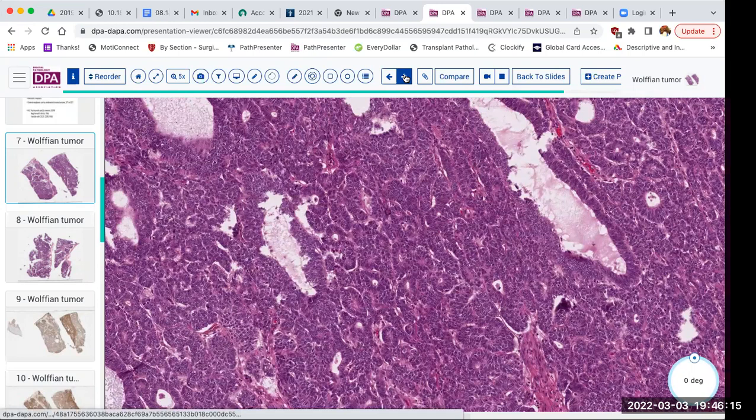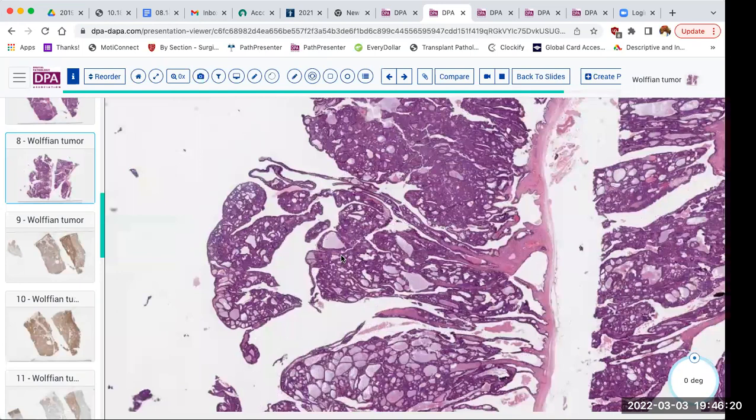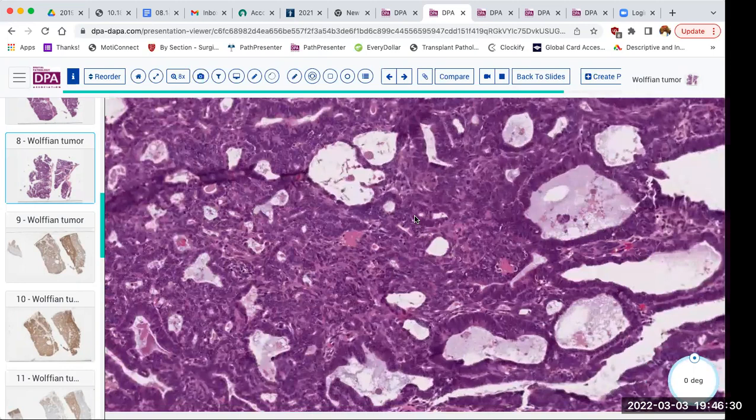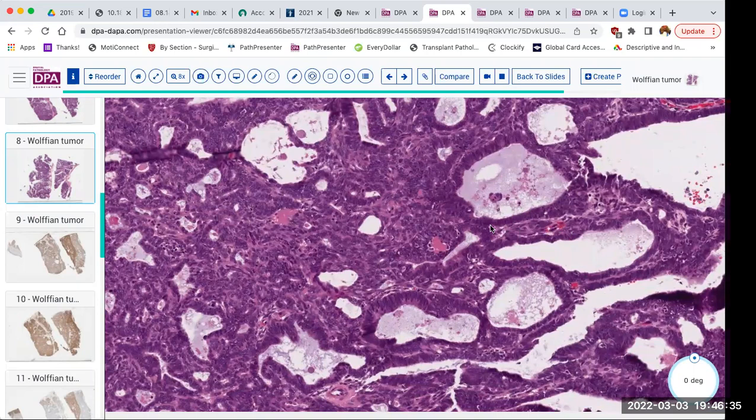Here you see much more of this follicular pattern, macrocystic spaces. So you wonder maybe it's even a mucinous tumor or something like that. But in addition to these nicely defined columnar cell lined glands, we have this stromal element that just didn't seem to fit with that. So we went to town on our immunohistochemistries with this, and I'll show you how we walked through these.